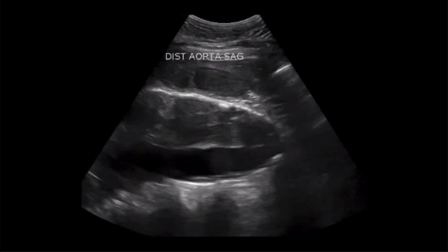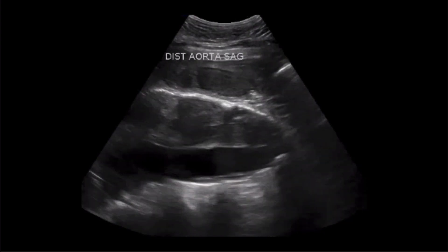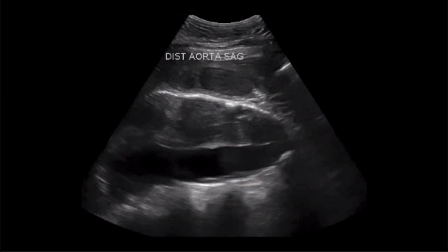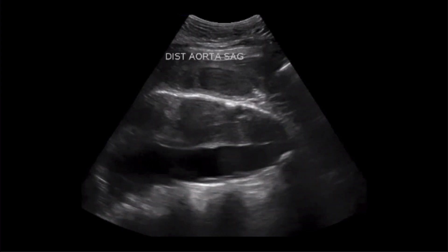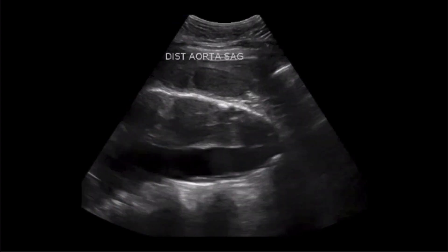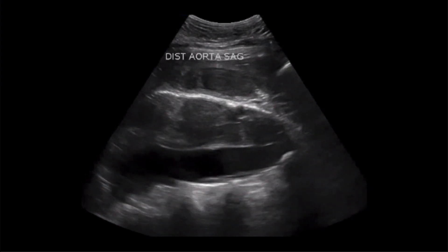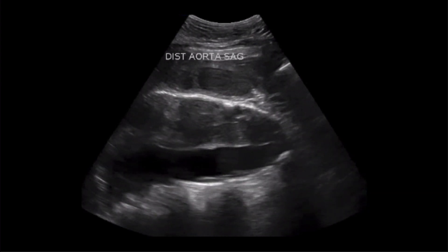The physicians rotate the probe 90 degrees to visualize the aorta in long axis. Again, we need to make sure the entire aorta is appreciated and not just the obvious lumen. The aorta is the entire structure highlighted in red. This can be confusing if you haven't seen this before, and similar to other imaging modalities, details and scrutiny of the images matter.